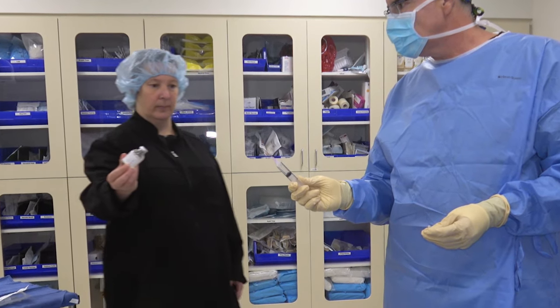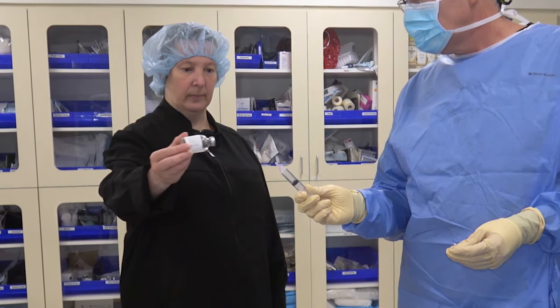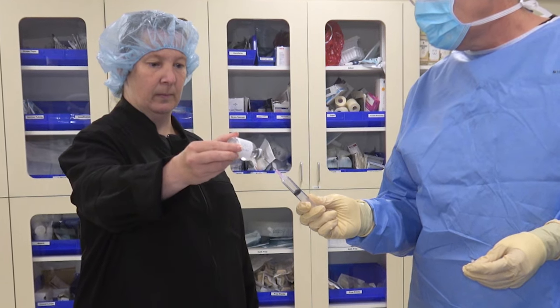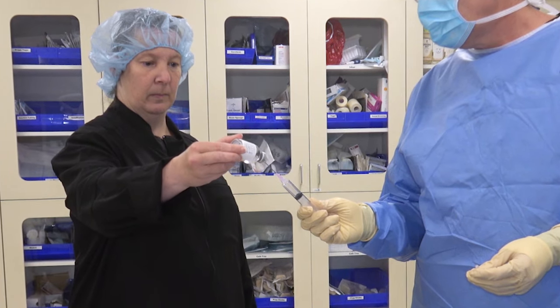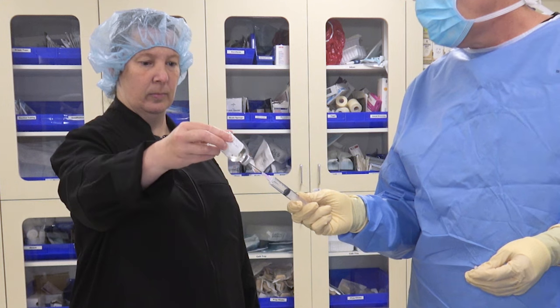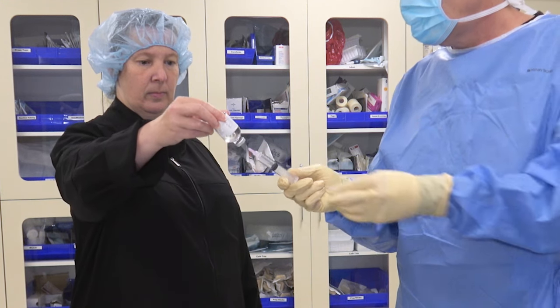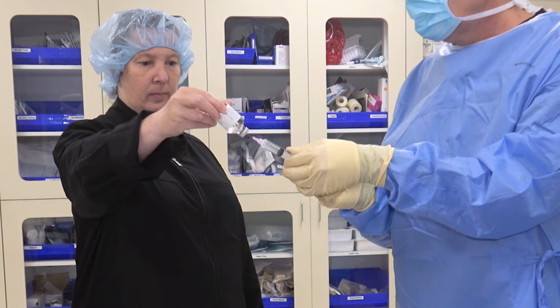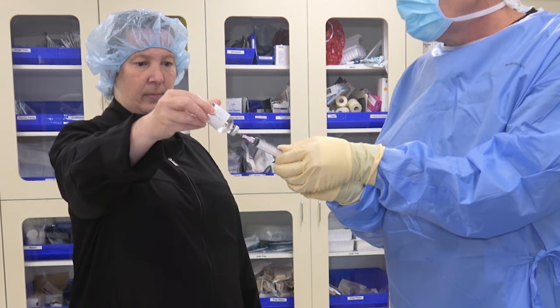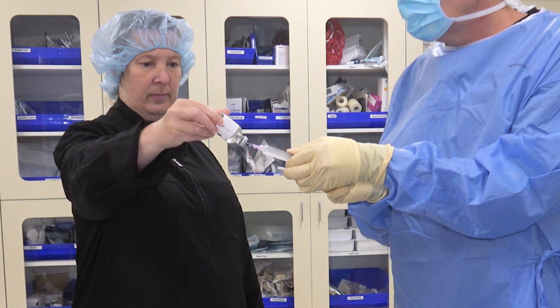Hold the syringe in a slightly upward direction. You do not approach your circulator with the needle — you hold it perfectly still, because this can be slightly dangerous to her. She is the one in control, she is the one doing the moving. Your circulator will then place the vial over the needle, position the needle so the tip is near the neck of the vial, press the plunger to inject some air into the vial, and then draw the medication into your syringe.